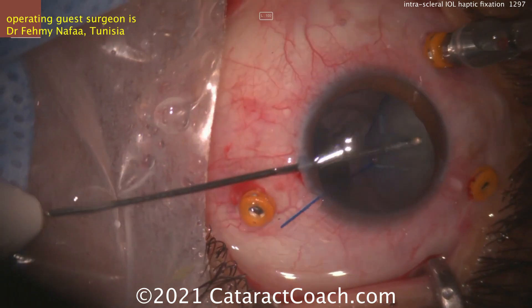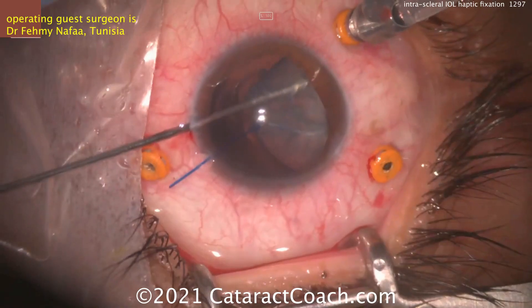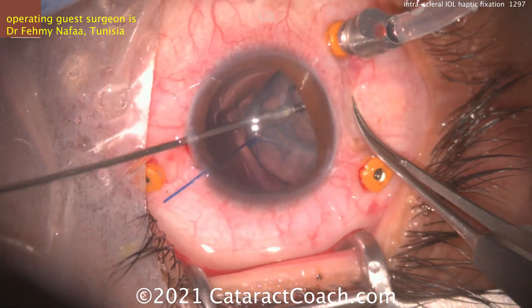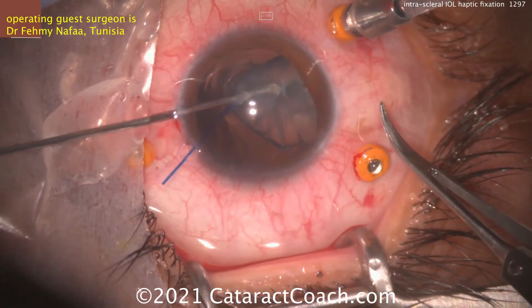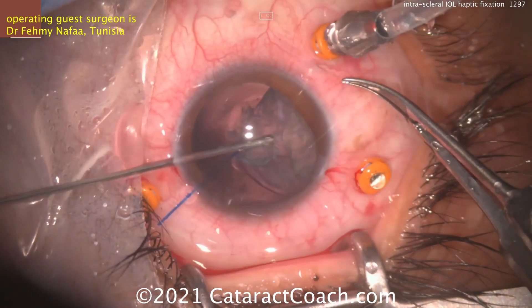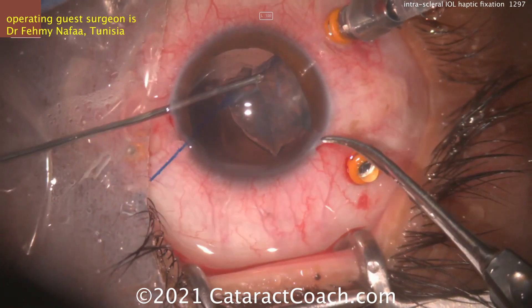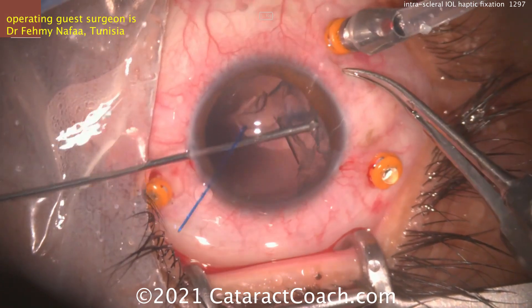Let's abandon those. In this case, you're probably better off, if you have the expertise, to do a pars plana lensectomy. Using a 23 or 25-gauge cutter — probably 23-gauge — to remove the entire lens, including the capsular bag, and just sacrifice the whole thing. You've got to be careful here: make sure nothing falls back into the vitreous. This is why you need to be adept at doing a full pars plana vitrectomy.